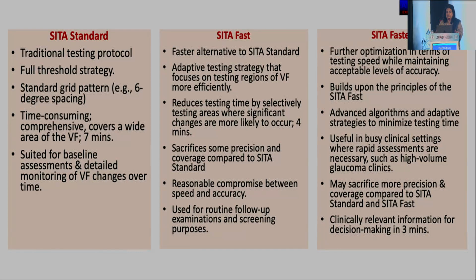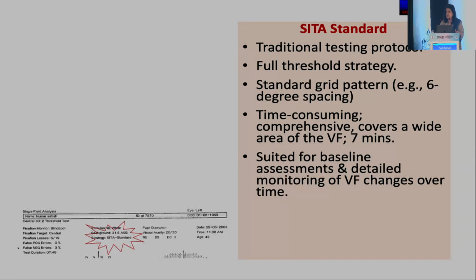Let's have a look at SITA Standard, which is the traditional testing protocol. It's a full threshold strategy. It tests the primary points twice, giving you an accurate result. There is a standard grid pattern of 6-degree spacing, but it's quite time consuming.